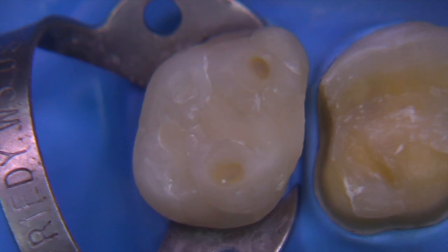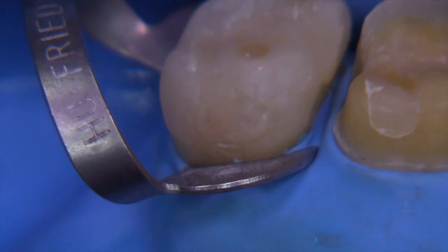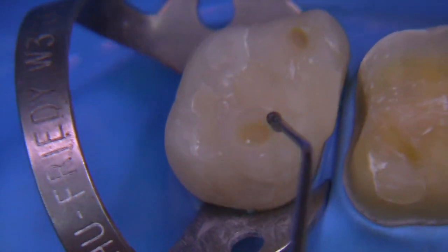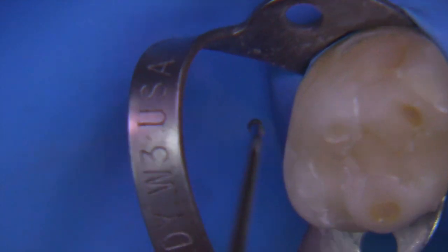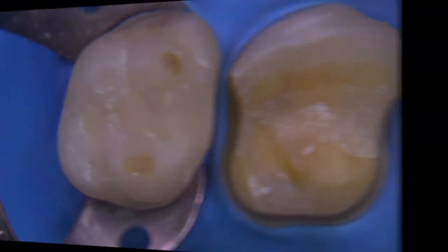If we look more carefully — let's take a look at the lingual first — this large composite is undermining the mesial lingual cusp and it's decayed. You can see it there in the over-contoured mesial composite, these huge facets that are decayed and problematic, and then of course the facial composite. So this tooth certainly needs a full crown.